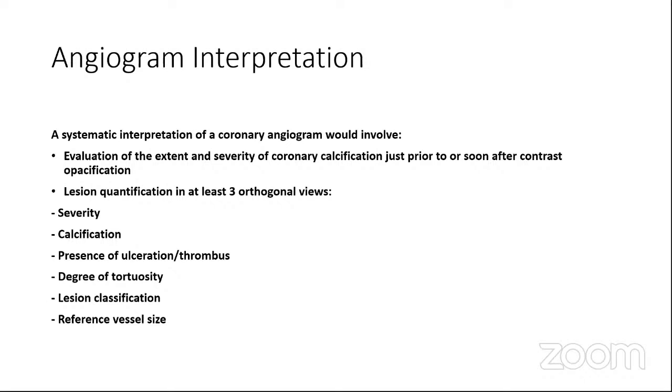Lesion quantification in at least 3 views, and we will judge the severity, the calcifications, the presence or absence of ulceration and thrombus, the degree of tortuosity and lesion classification, and reference vessel size.